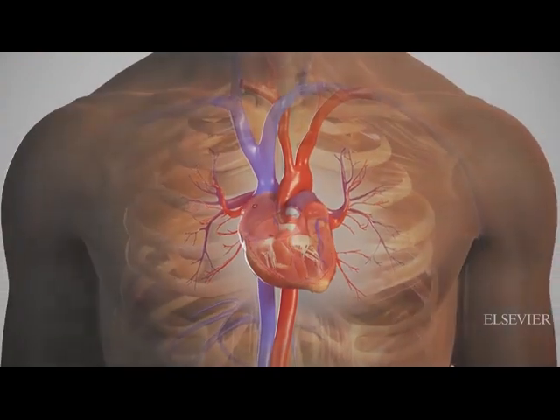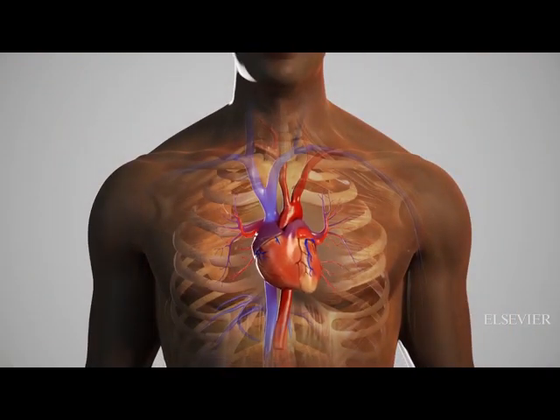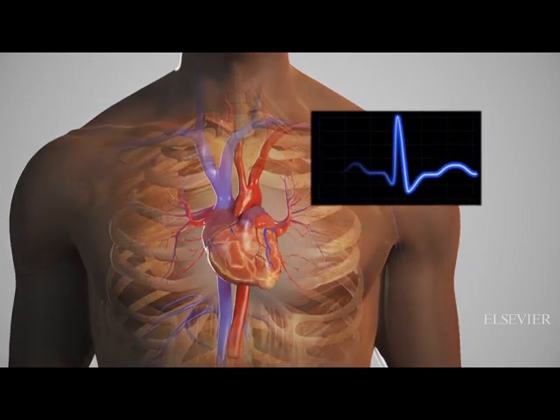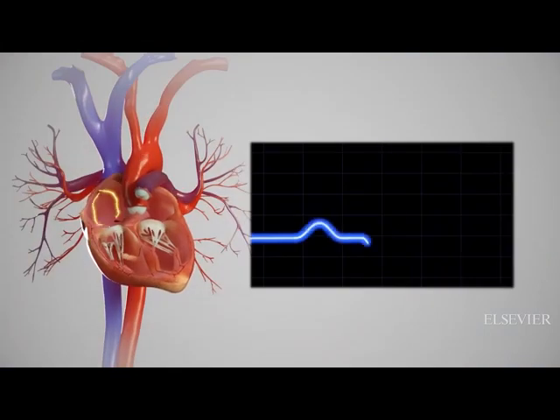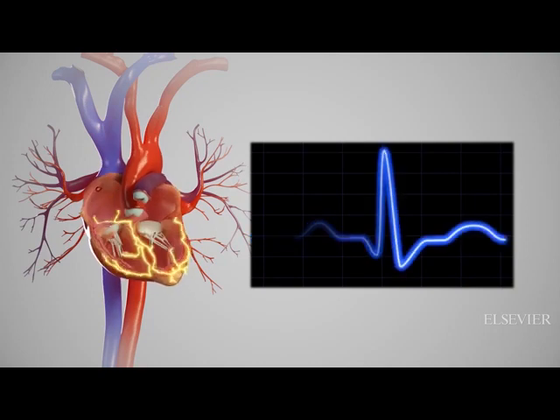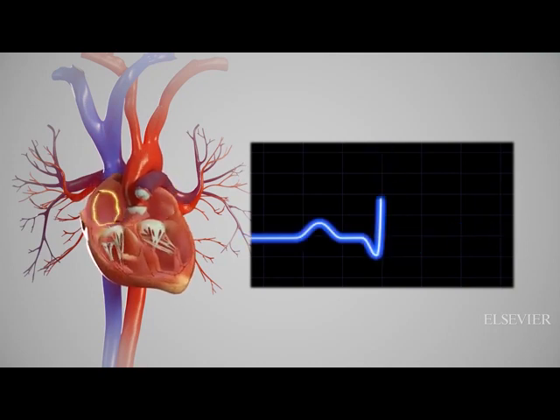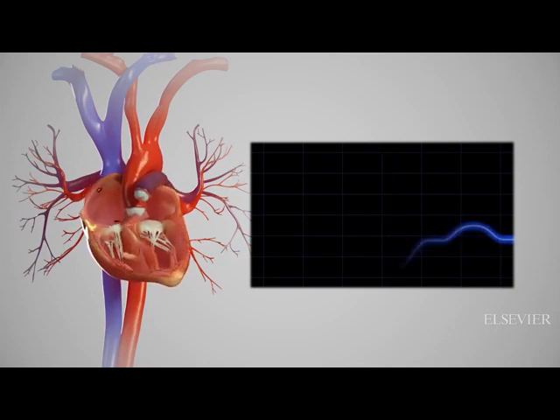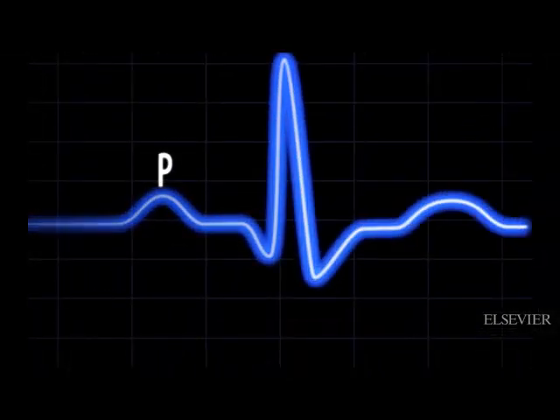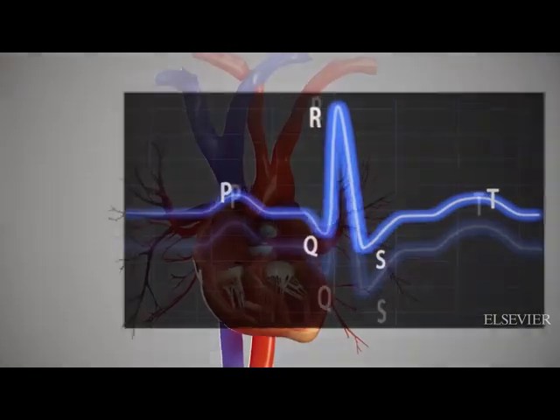An electrocardiogram, also known as an ECG or EKG, is the graphical recording of the heart's electrical activity. The ECG records two physiological events: depolarization, or the spread of a stimulus through the heart muscle, and repolarization, or the return of the stimulated heart muscle to a resting state. Specifically, each ECG waveform, interval, and segment reflect a specific aspect of the heart's electrical conduction activity.